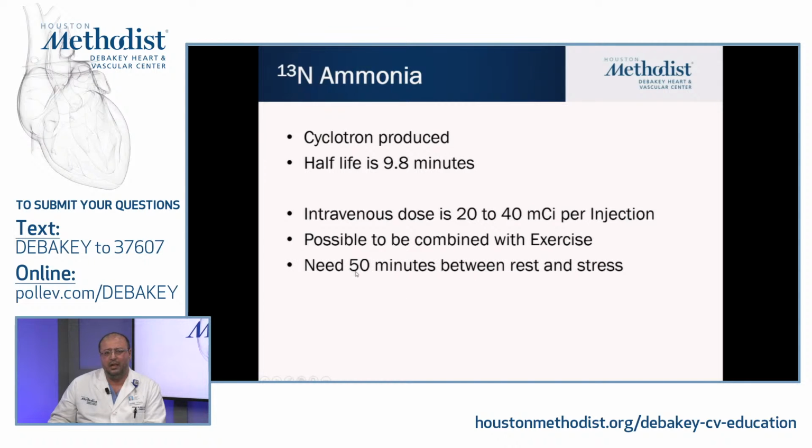And if you are using an older system, not the new digital systems which allow for newer tricks, the regular PET ammonia protocol needs a 50-minute difference between stress and rest to allow the rest dose to decay before you go ahead and do the stress.